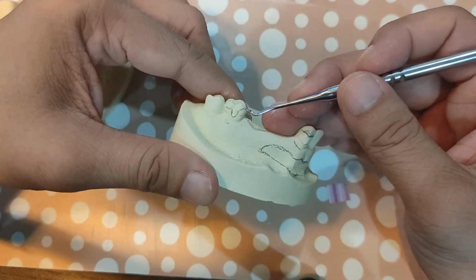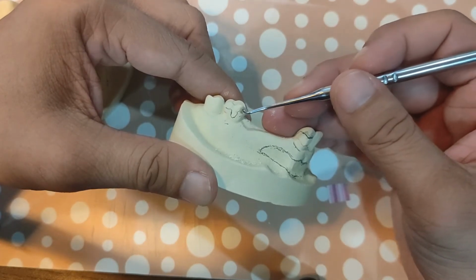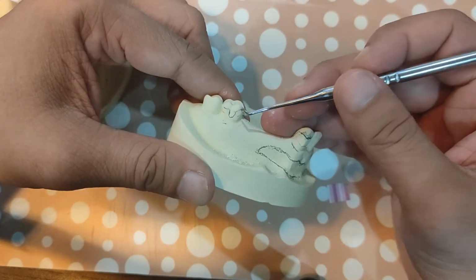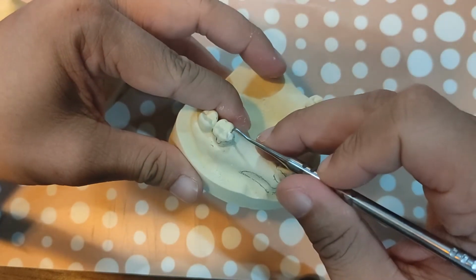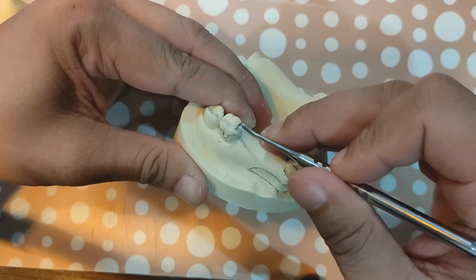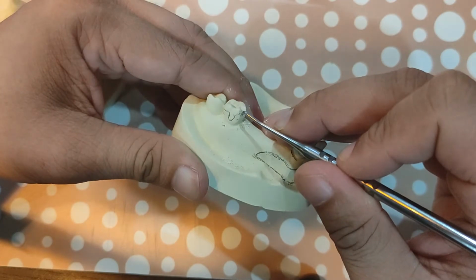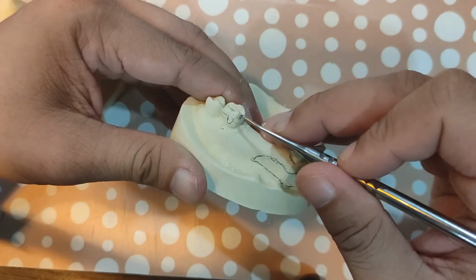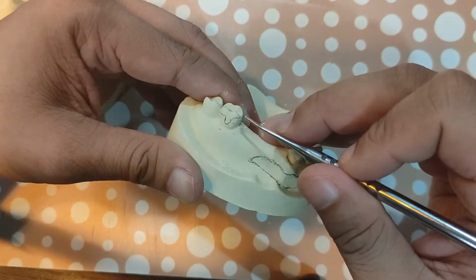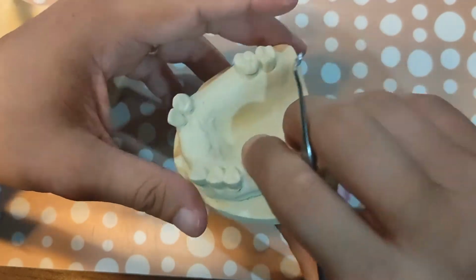Okay? Also, if you will see that the survey line here is a bit too occlusal. Right? So anong gagawin nyo dyan? I'll leave that up to you. Kung anong pwede mong gawin dyan. This type of survey line is unacceptable because remember, a rigid part, if it's going to be emerging from the mesial rest, the clasp, I mean the retentive clasp, and it's going to be a suprabulge, hindi pwedeng ganito kataas yung survey line mo. Here, on the mesiobuccal aspect. So you have to do something about that. I'll leave that up to you. Okay? Alright.